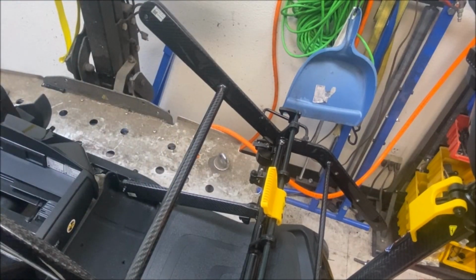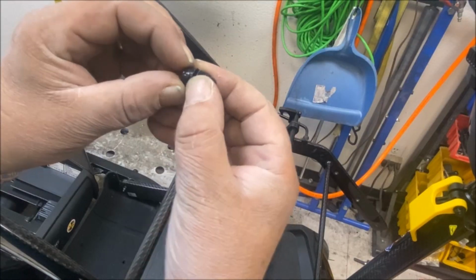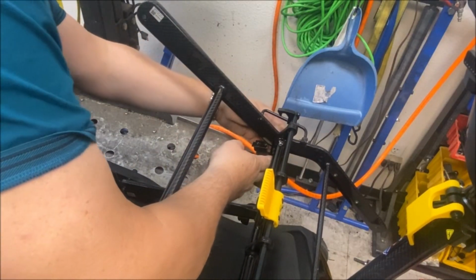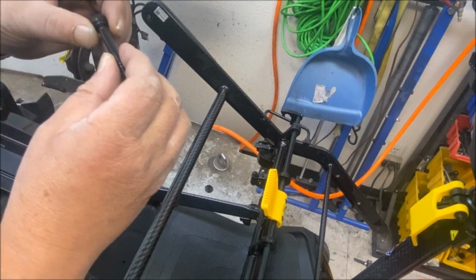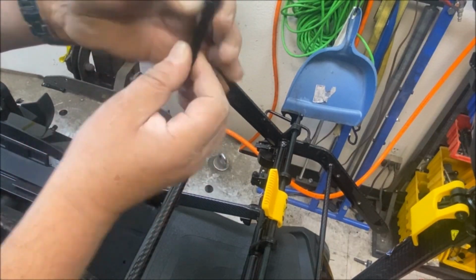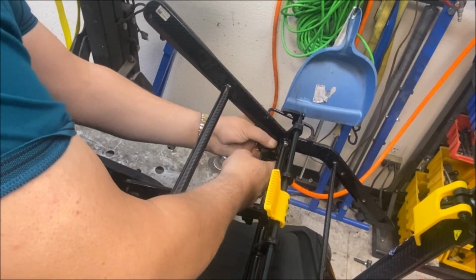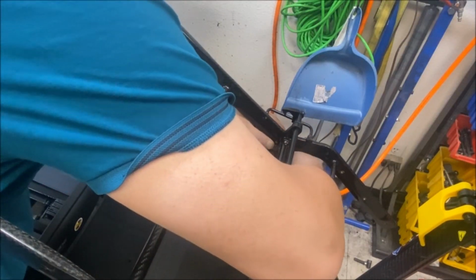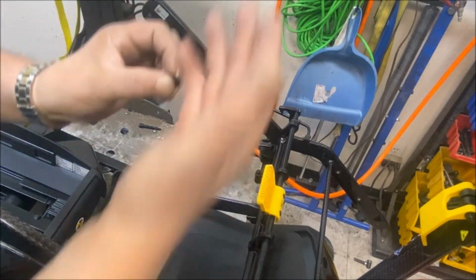Okay, so it comes out, you've got a acorn split washer and then the insert for the actual carbon fibre. Then you've got your bolt going through. There's a bit of grease on there, and you've got another insert on the bolt side. And then there's a washer and an insert on the actual frame itself, so just be careful you don't lose that. So there's another insert on this side.